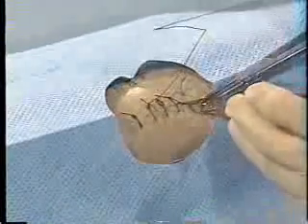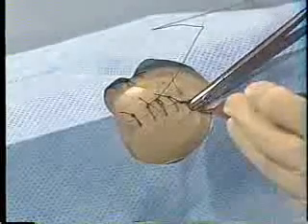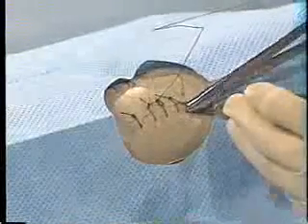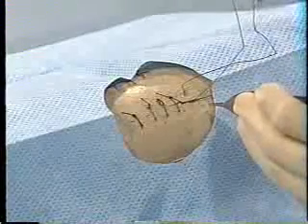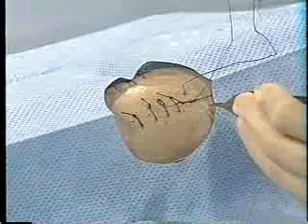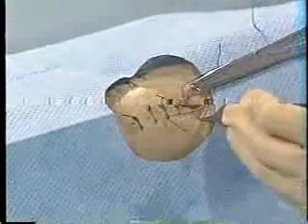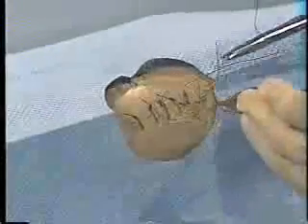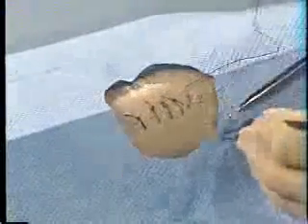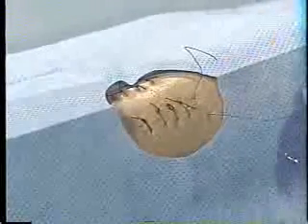If you are taking 2 bites, let go of the needle and re-grasp, keeping the palm facing down. Avoid grasping the needle with your palm facing up, as this will make it hard to turn the wrist in a smooth and natural manner. Insert the needle into the opposite side of the wound at the same depth as the first side. Note that it's not always necessary to hold the skin edges with the pickups. If you do use the pickups to hold the skin, use them gently rather than leaving rat tooth marks in the skin.